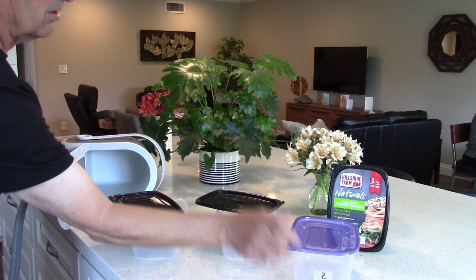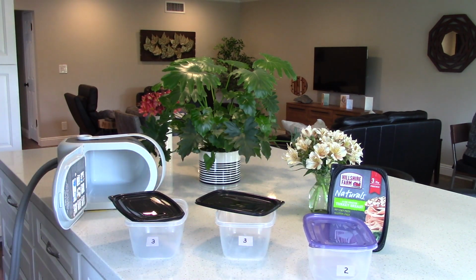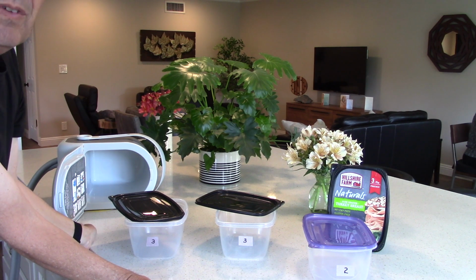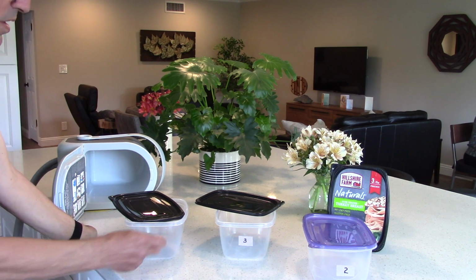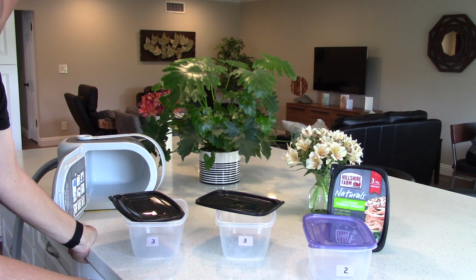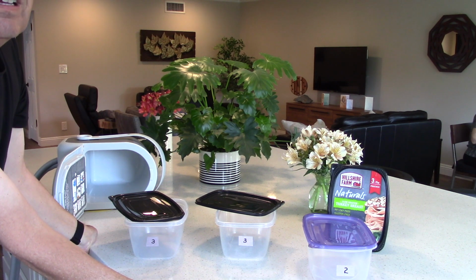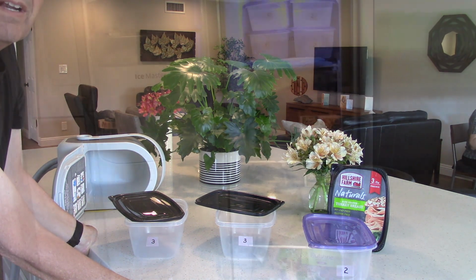If you cannot get those, you can buy these at Target, and you'll notice I have a numbering system on there, and that numbering system really is a help to you when you're using this, especially if you're using it 24/7. In the middle of the night, you don't want to get up and look around and try to find which one of these tubs is frozen solid, and that's a problem we had. You hold it up and there's a bubble inside. They take about 10 to 14 hours to freeze, and so you need a number of them in your rotation. And I'll show you the system that I use.